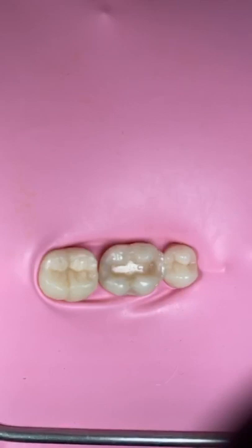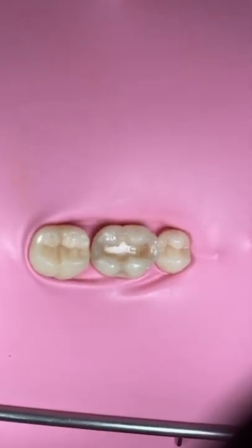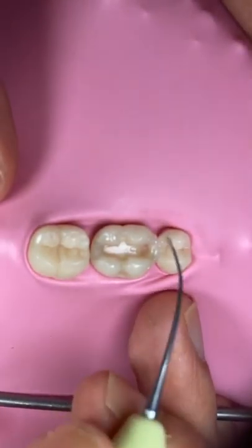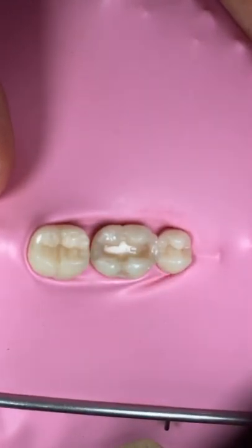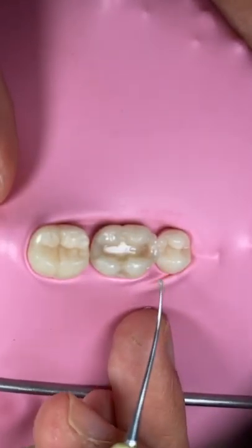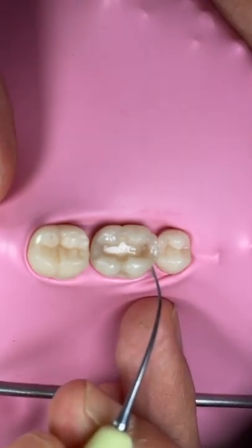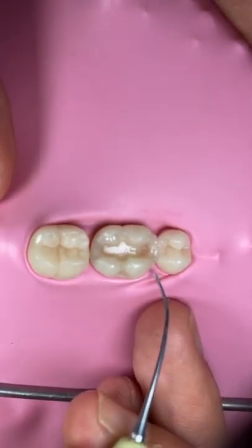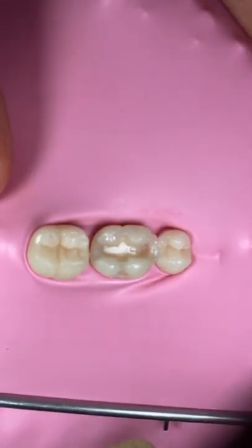So if you maybe wonder why I can make it very round, smooth, this is the secret, you know. So I close that area to make it smooth with the flowable, because sometimes there's an excess there that you need to close with the flowable. Okay.